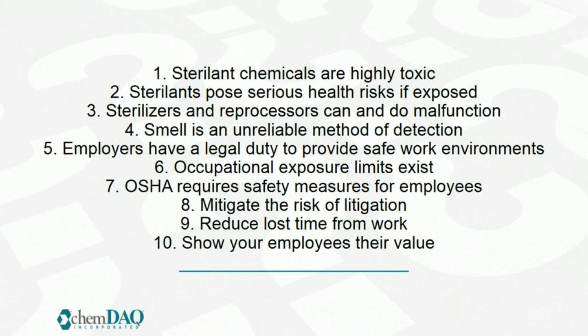Number 4, smell is an unreliable method of detection. Number 5, employers have a legal duty to provide safe work environments. Number 6, occupational exposure limits already exist. So why are we not enforcing them? Why is ethylene oxide enforced, but hydrogen peroxide not, when they both have the exact same part per million exposure limit set at 1 part per million?